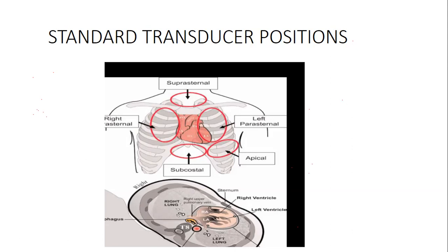Very good for pericardial effusion, which doesn't mean you cannot see pericardial effusion on these other views. You can, but this is one of the best. When we come to congenital anomalies, I'll also show you why the subcostal view is very important, because it helps you understand certain dropout artifacts. This is called the subcostal.